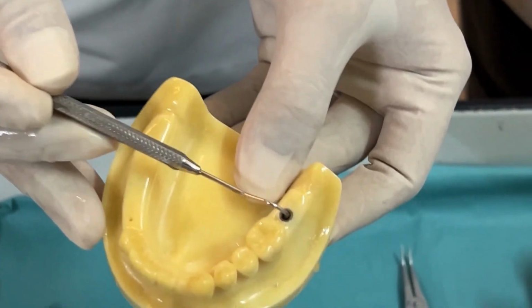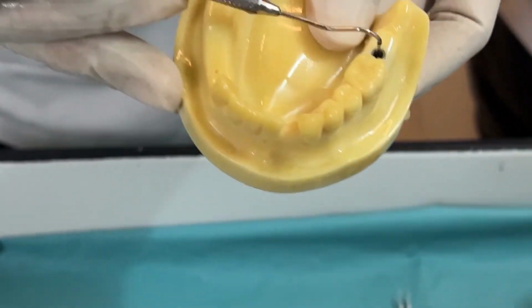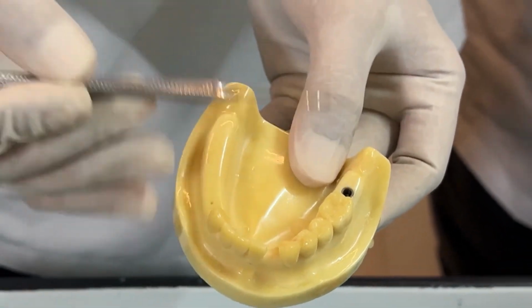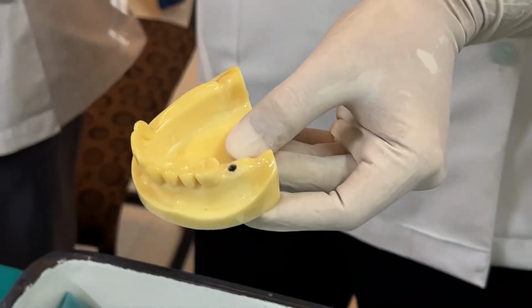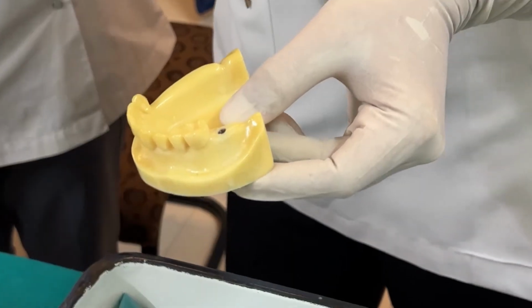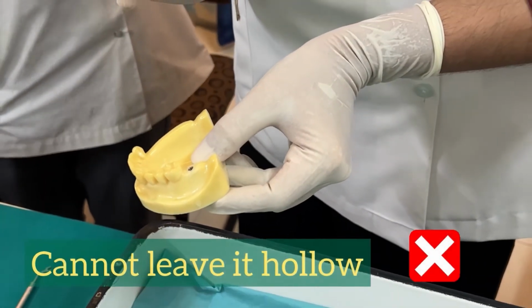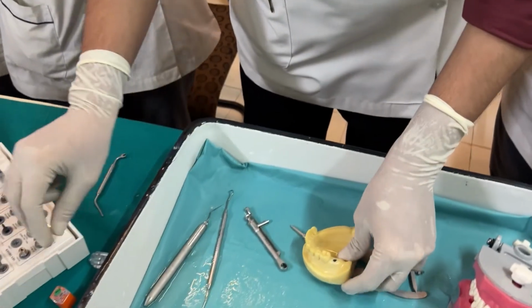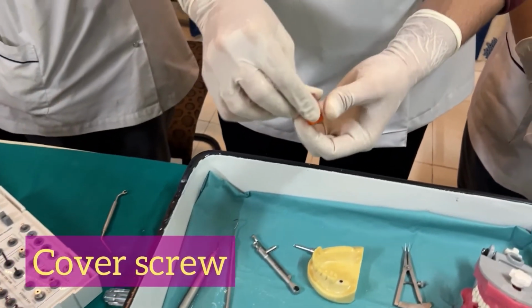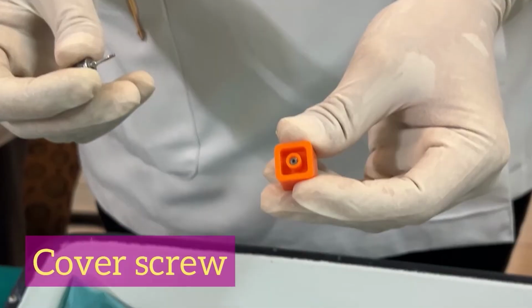Now this implant here is hollow. What do you call this portion of the implant which is hollow? Crest module. This is where the abutment part would be going inside. But the point remains the same. Can I leave it hollow like this? The tissue will grow inside this. So I need to attach something known as cover screw. So this is the cover screw which comes in the iFix kit. It comes in all the implant kits.